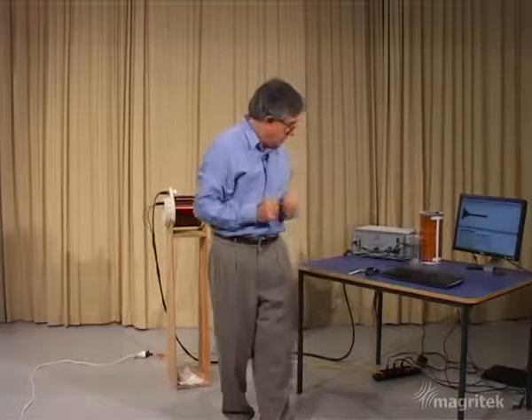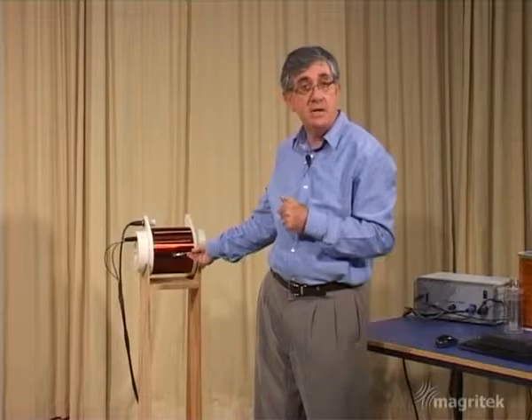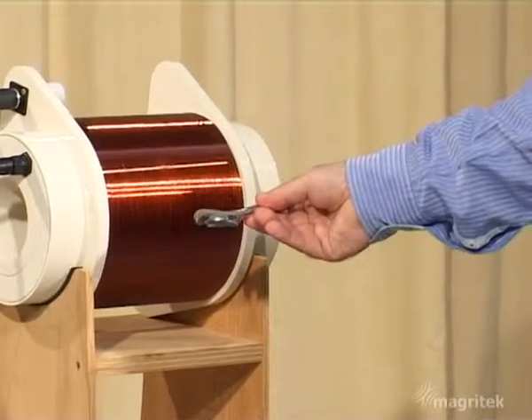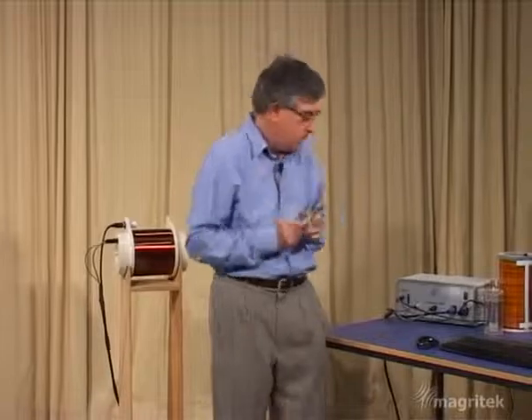Now I can demonstrate that to you in a very simple experiment. And to do so, I'm going to use this crescent spanner over here. Now this spanner's definitely got some magnetism associated with it. So if I were to bring it close to the probe, it would definitely disturb the homogeneity of the Earth's magnetic field. So what I want to do is to repeat the free induction decay experiment with the spanner nearby. Let me do that.